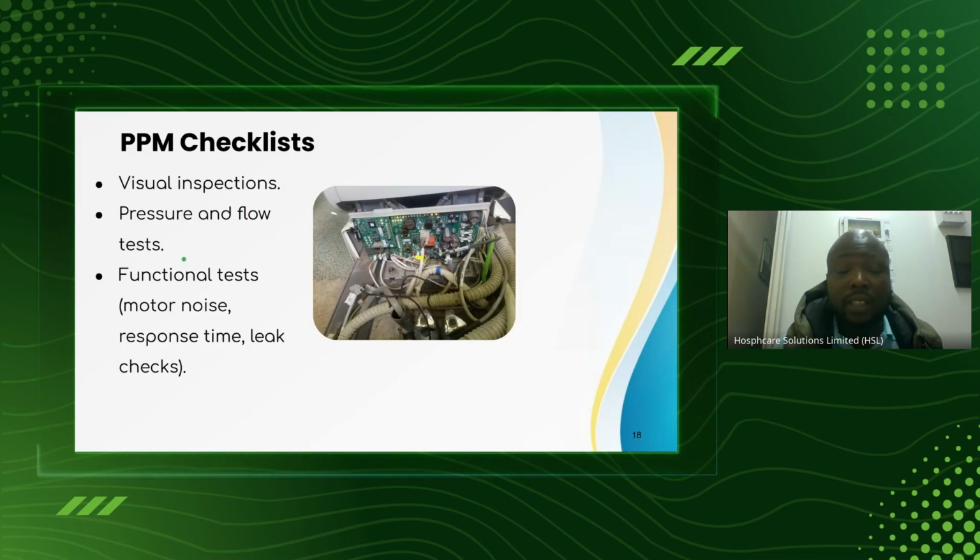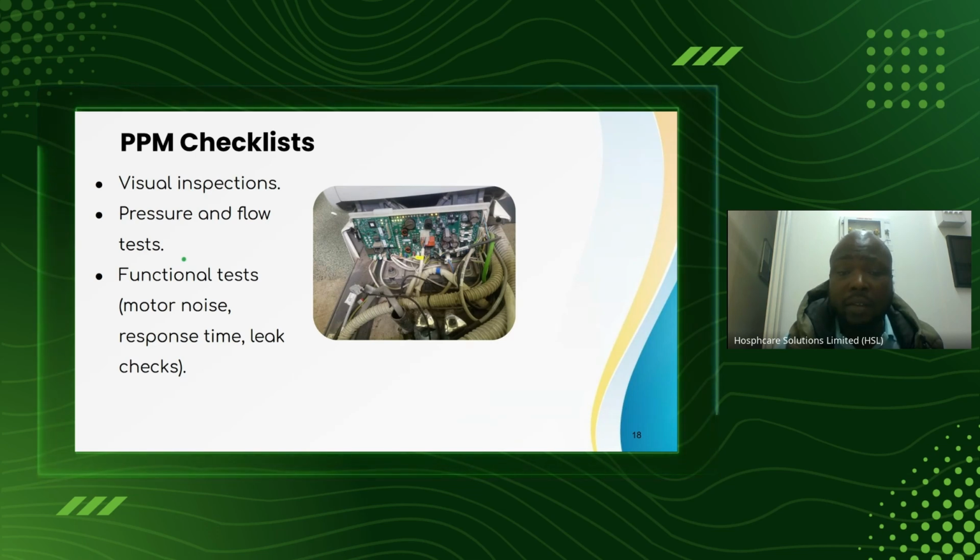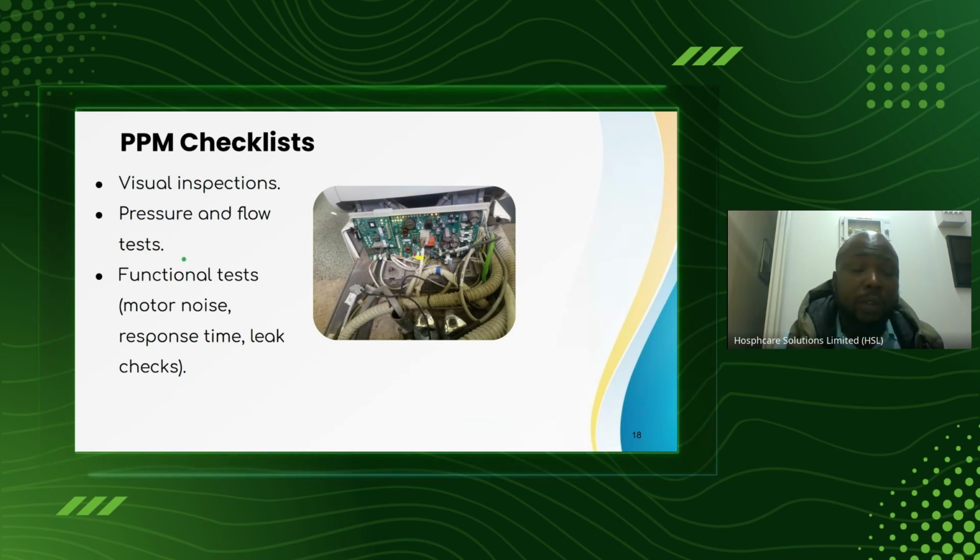of the motor, the noise. I've told you the reason why the units make a lot of noise. Normally people rush to the motors and the telescopic, but it's only the surface. The flow is not uniform.